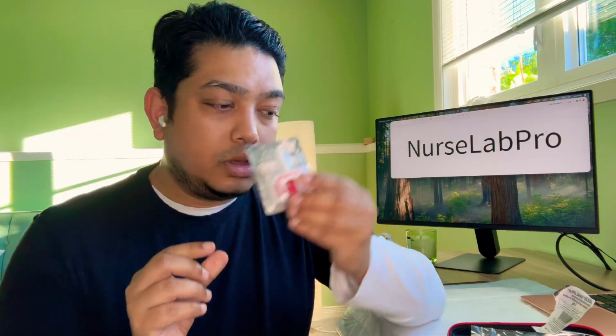Then you put the nozzle in their nose, and you press this. This is an expired one, so I'm not going to press it, but when you press it, it goes up and delivers a dose of Narcan or naloxone, and then you wait for 2 to 3 minutes. If the respiratory rate is not more than 10, it's time for another dose. Also, I would be calling 911 when I give the first dose. Or if you're in the hospital, you inform the physician, the doctor, right away.